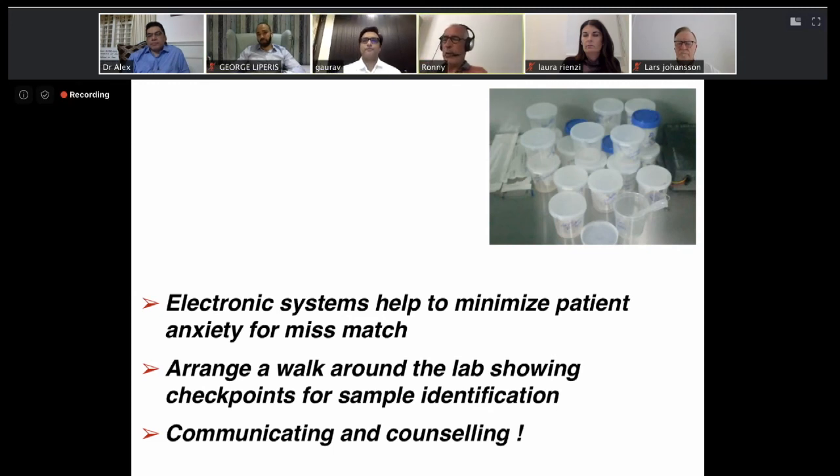Yeah, Ronnie, please go ahead. Yeah, just one comment. I don't agree with Alex saying that it's a tool for quality control. Doing quality control in IVF is too late. What we should do is quality assurance. We need to prevent errors from happening, and that's why you need these tools. And again, it's part of good manufacturing practice. But we should not forget that zero risk does not exist.